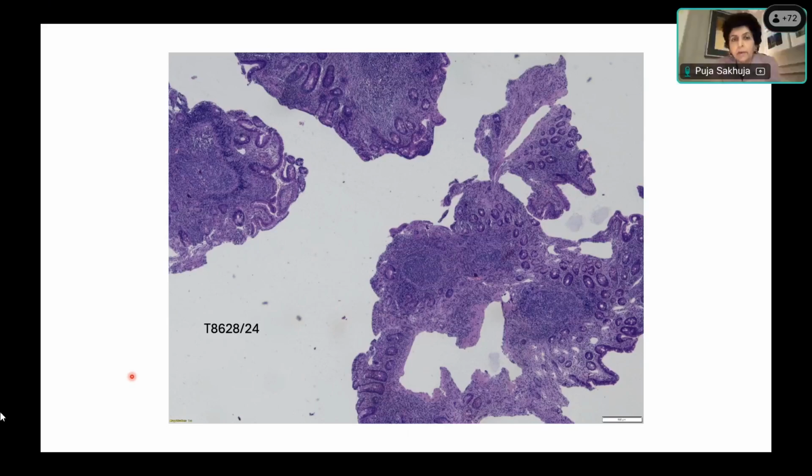Yes. But is there something that we should ensure in the way the sample is before we comment on the villus pattern? Otherwise, we may make mistakes. In this case, it didn't really matter, and you're probably right. It's more or less normal, but it's not an optimum or suitable biopsy to comment on villus pattern, right? Okay, ma'am. What is a suitable biopsy when we should comment on villus pattern? What should be the orientation of that biopsy?